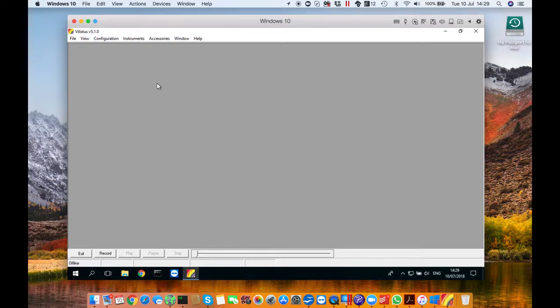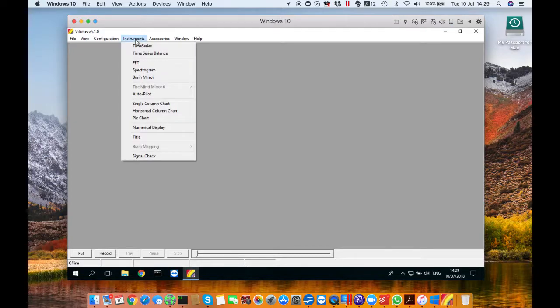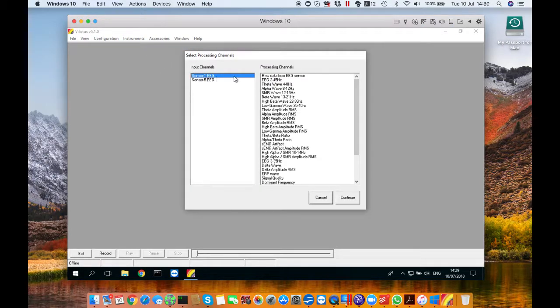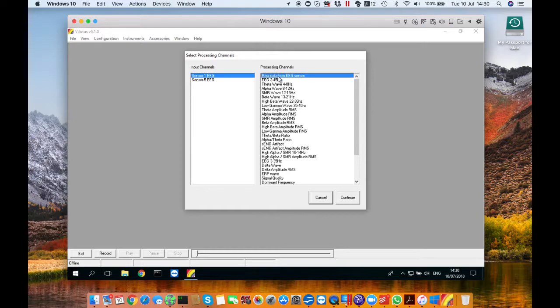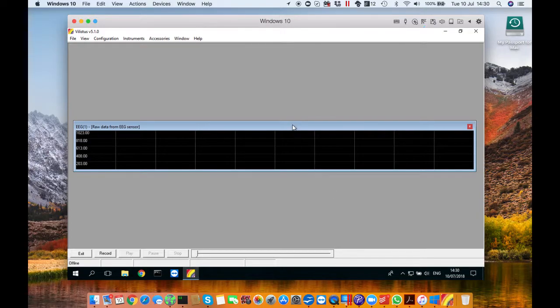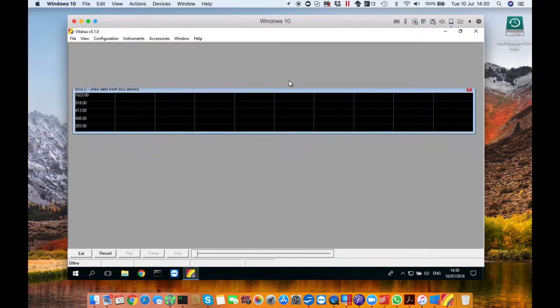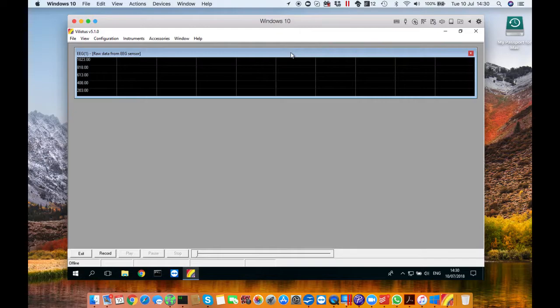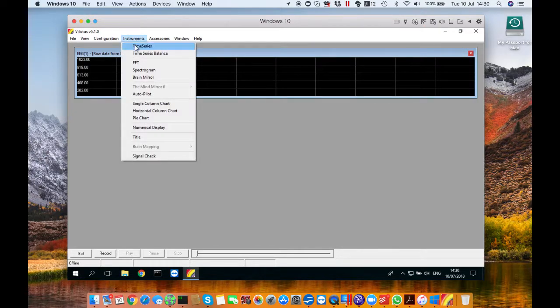So now we're going to start setting up the screen. Go to instruments then time series and you'll see this window pop up. I want you to select sensor one and then the raw data option on the right hand side. It should be at the top. Click continue and you'll see this graph come up on screen. I recommend that you place it towards the top because there's going to be two of them and there's going to be a few other things coming onto the screen as well.